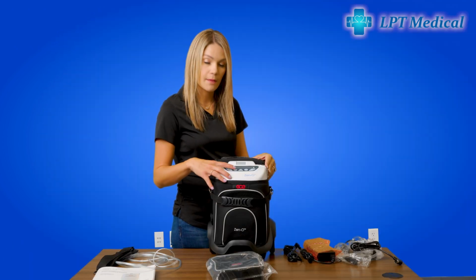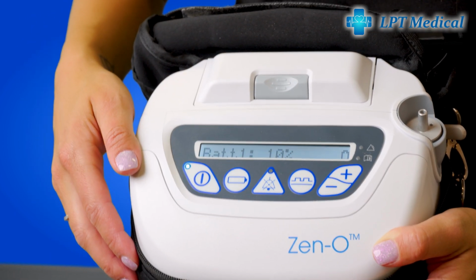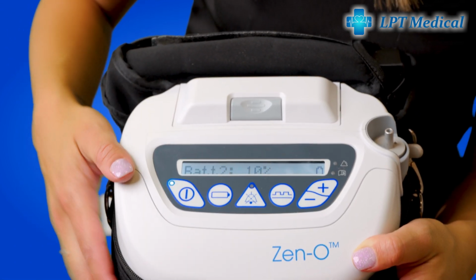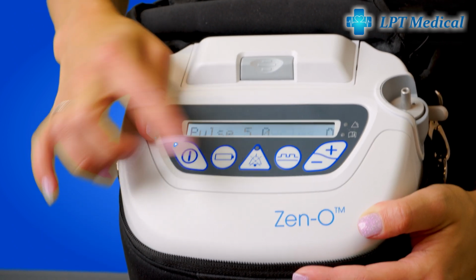So there is a battery button. So this will tell you how much percentage each battery has because it does hold the 2 batteries. And it will also tell you how many cycles the batteries has been charged on each battery.